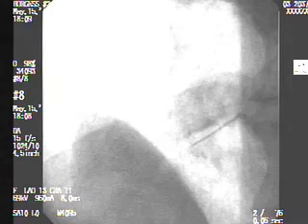By doing that, we deliver the drug to the blockage within the old stent, and that seems to be quite effective. One of the other techniques to use in that situation is radiation therapy, which we have done quite a bit at Borges. But I think the drug-eluting stent is probably going to replace that.